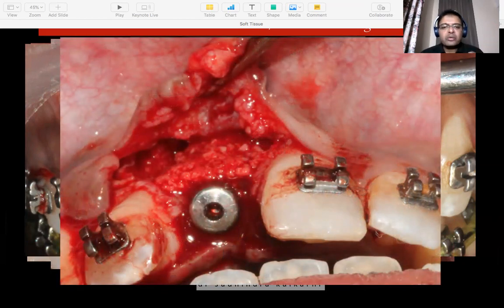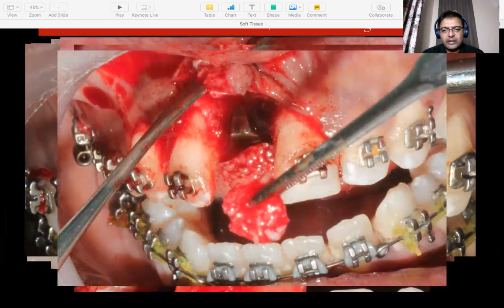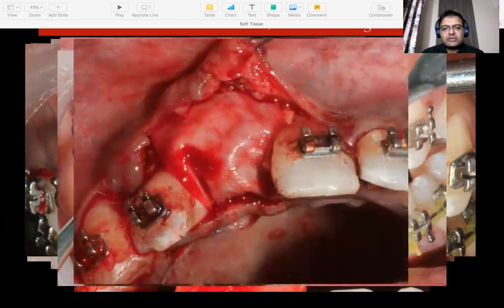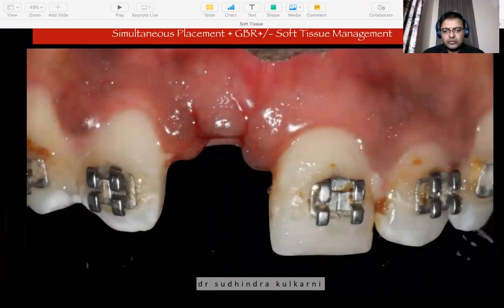You don't use a dead bone against a naked thread. If you have naked threads, then it should be always and always layered with native bone, autogenous bone, and then followed by any graft material. Once that was done, that's the autogenous bone that went in. And to protect this graft along with the membrane, we use a piece of connective tissue underneath the buccal flap to close it down.